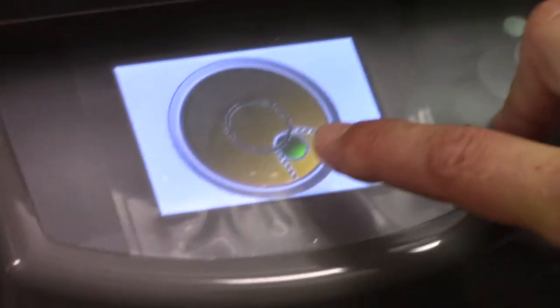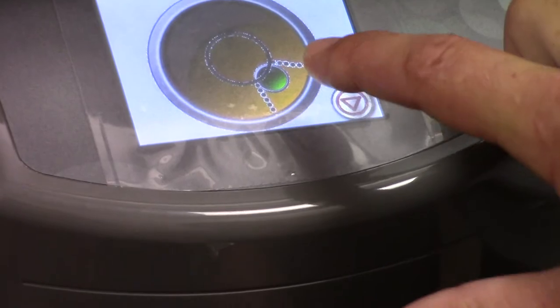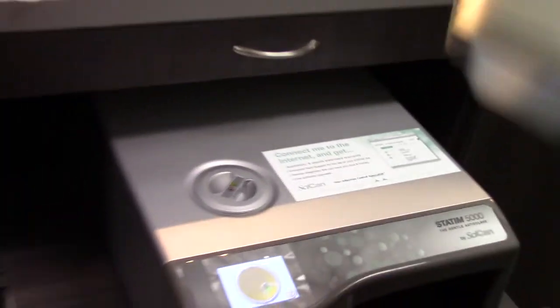So once we push it back in, it has to be level. It has to be level, yeah. So what leveling does is it helps it drain. So right now it's in the green, so we're good. What it's doing is it's angling it back into the left. It drains from back here. So over time, when you incorporate that, it just helps the water shed and drain. It helps it dry better.